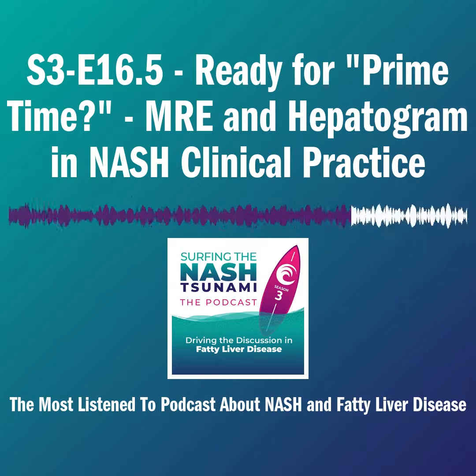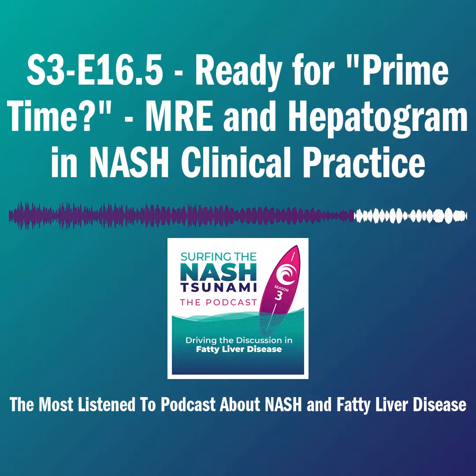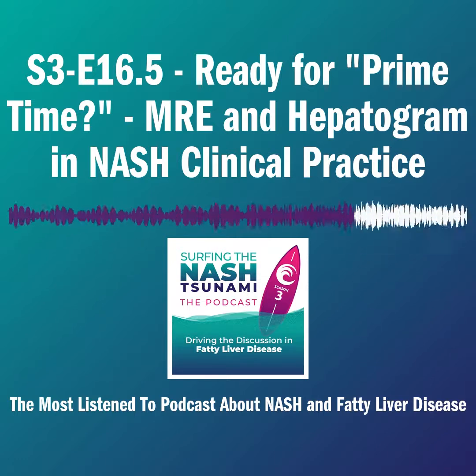And I'll just add, incidentally, Scott, you made a comment very early on about having your own MRE done and that it jiggles the liver. So just parenthetically, in our NASH patients, when we originally send them to MRE, they can actually have some discomfort because Glisson's capsule is stretched. If you are set up for intermittent right upper quadrant pain, when you jiggle the liver like that, we've had patients come back and say, yeah, that hurt.